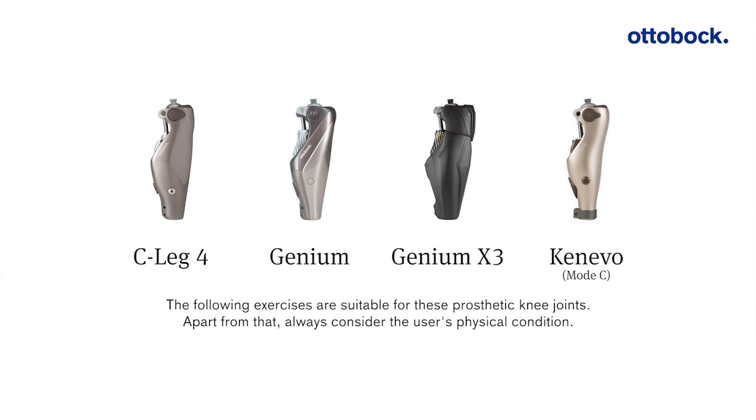The following exercises are suitable for these prosthetic knee joints. Apart from that, always consider the user's physical condition.